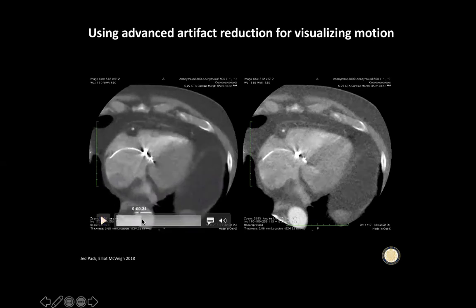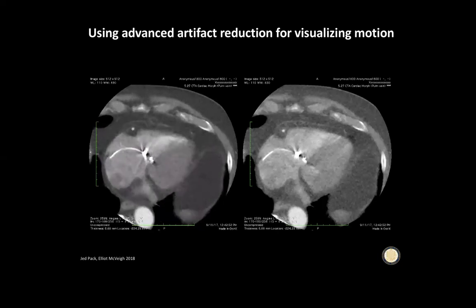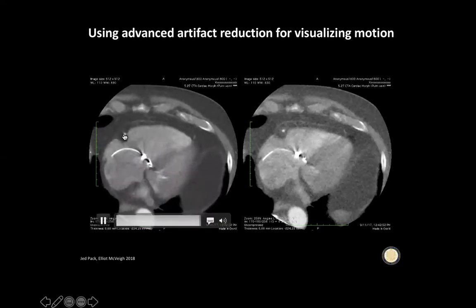There it's sort of stationary. When we go here, you can see the vessel is an arc, right? And we go to a different phase and the vessel looks like it's got two wings and a body, etc. Right? And then there's another arc, and then it's stationary again, and then there's another arc. So that's called motion artifact. And the problem there is we're not acquiring the data fast enough to claim that we're freezing this motion, right?